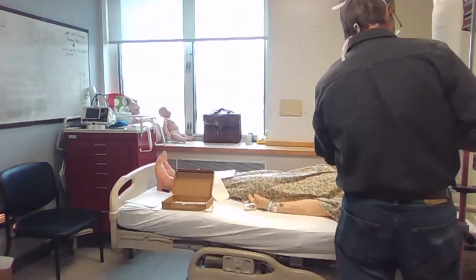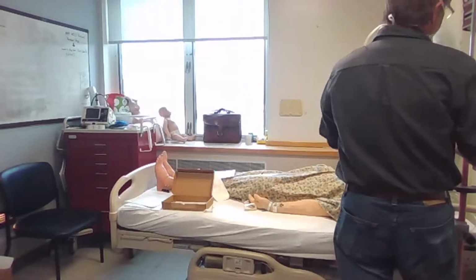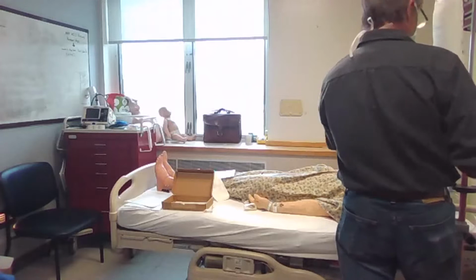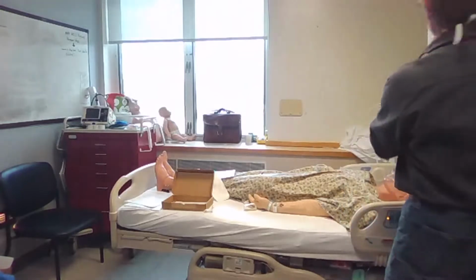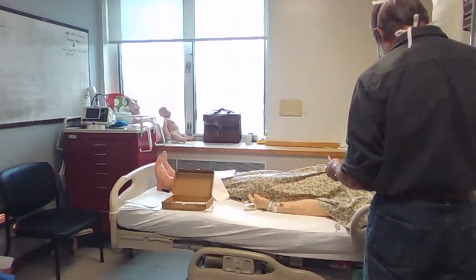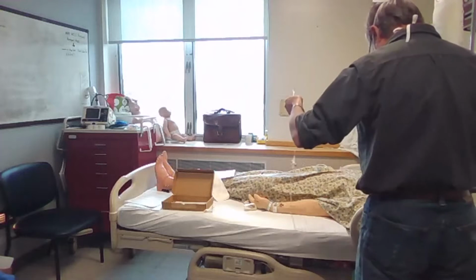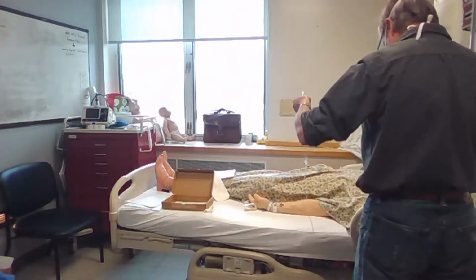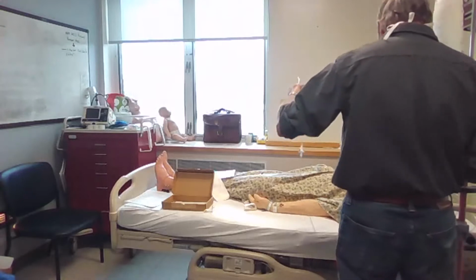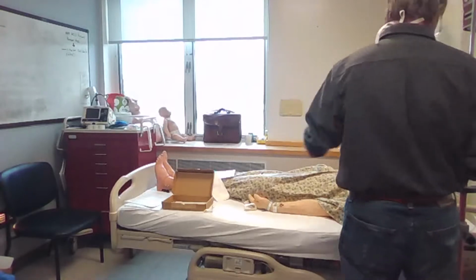This is always the problem. The bag wasn't that full. The bag had a lot of air in it. So as we were just talking about, the saline bag was like half full, so it had a lot of air in it. So as soon as it was compressible. Let's see it go. Come on.